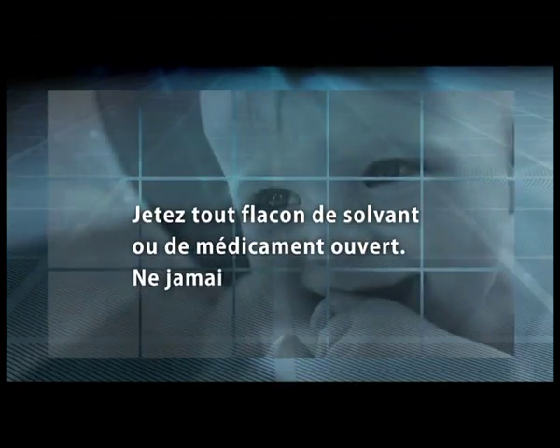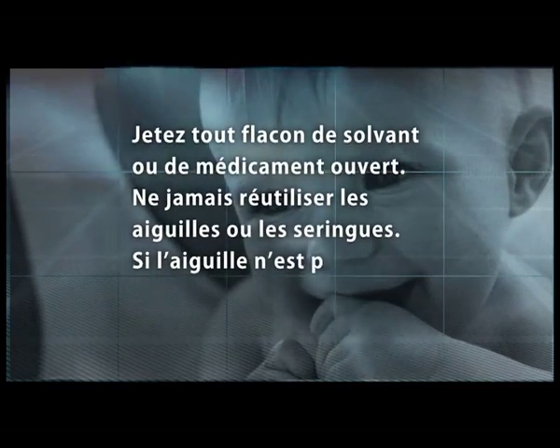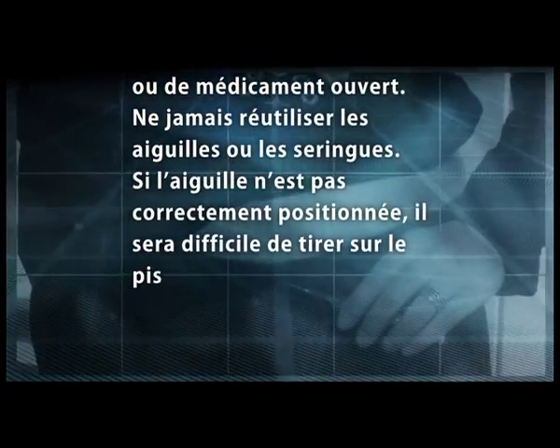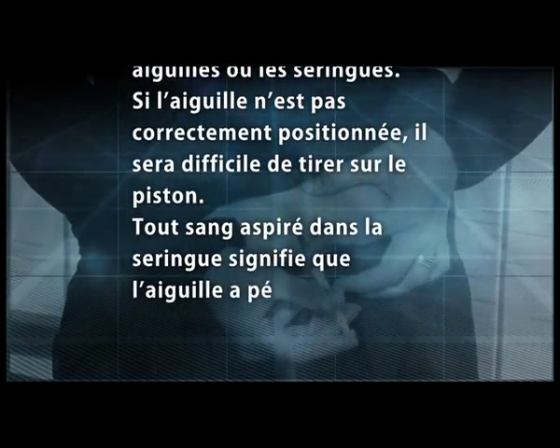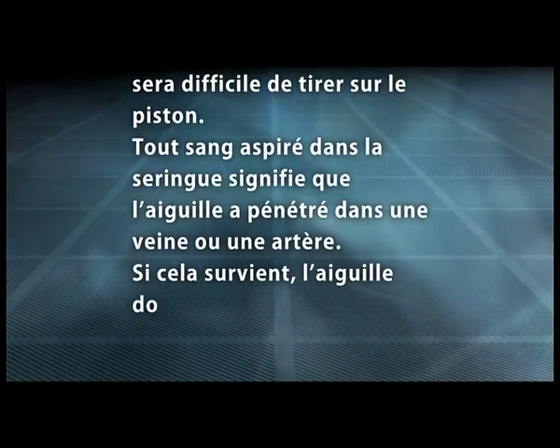Discard any open vials of solvent or open vials of medication. Never reuse any needles or syringes. If the needle is incorrectly positioned, it will be difficult to draw back on the plunger. Any blood drawn into the syringe means the needle tip has penetrated a vein or artery.